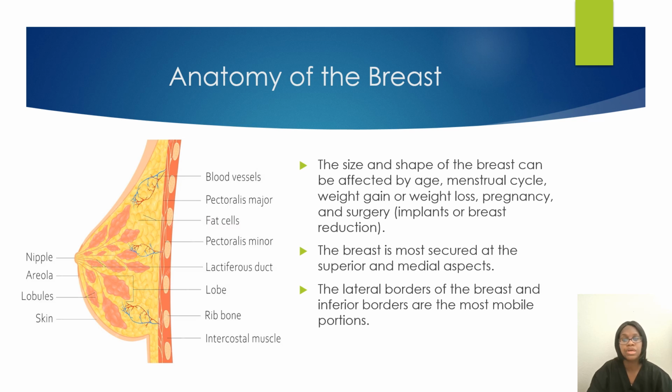It is very important to know the anatomy of the breast tissue because you also want to make sure that you are getting a good image with the nipple, that you are seeing all the way to the pectoralis muscle. And then sometimes, depending on how well a patient can position, you will see their lymph nodes too on the MLO views.